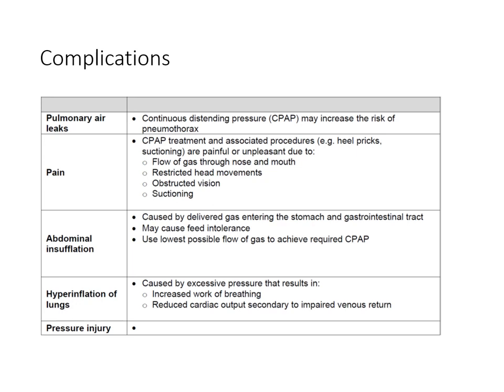Hyperinflation of lungs can happen when we do not start weaning CPAP when the baby has become better. This can lead to lower venous return and a fall in blood pressure that can cause increased lactate and metabolic acidosis. And the baby can start to look sick again. So we need to also be mindful of when the baby is better and when we should start weaning CPAP.